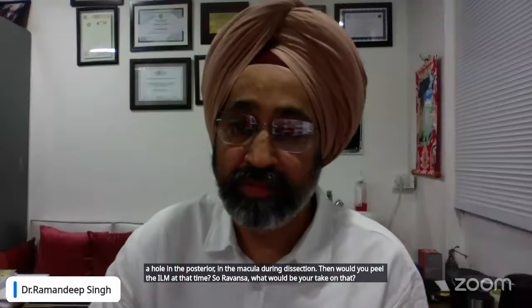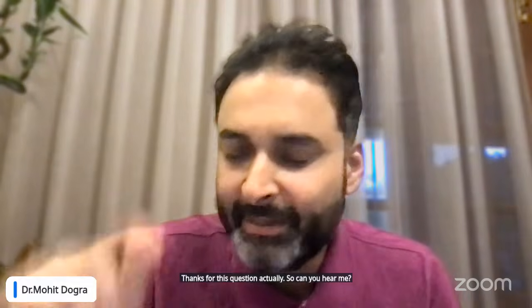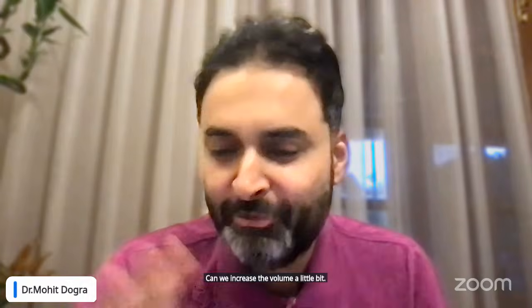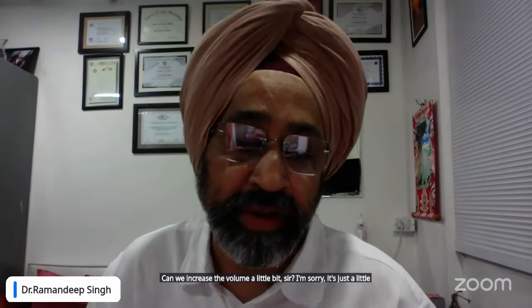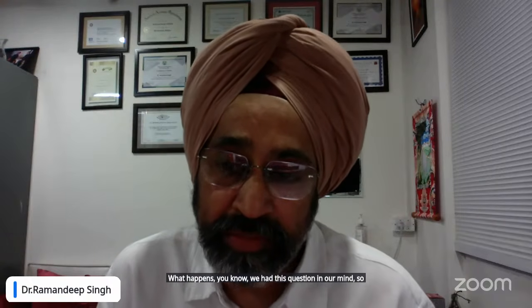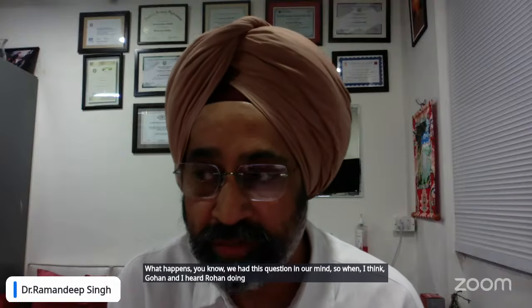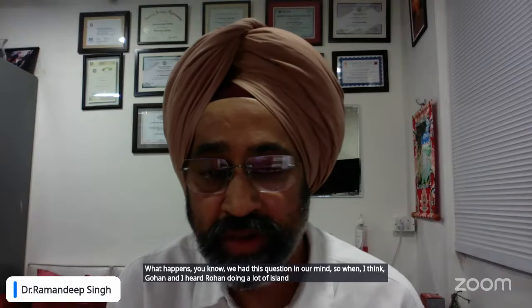Thanks, Mohit, for this question. We had this question in our mind. When Rohan and the Delhi team were doing a lot of ILM peelings, we did an IOCT-based study.